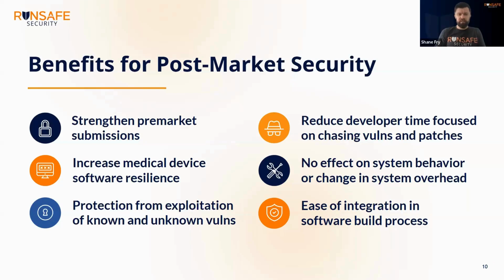Yeah, so we've got a couple of things that we've done there that's really helpful. So a lot of what we have done over the last 3 or 4 years with academic researchers is applicable here. So we've taken on some studies with North Carolina State University to take a look at the prevalence of memory safety vulnerabilities and how long they take to get patched, and what vulnerabilities are being targeted. And so we did some academic studies with them where they did some machine learning approaches of analyzing thousands of exploits to determine actions that exploits are taking on devices, to look at which actions on devices we can actually impact. And actions here aren't necessarily we moved a servo or we adjusted a fluid rate or something like that, but more low level at the processor level and operating system level.